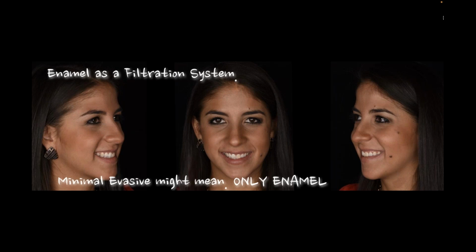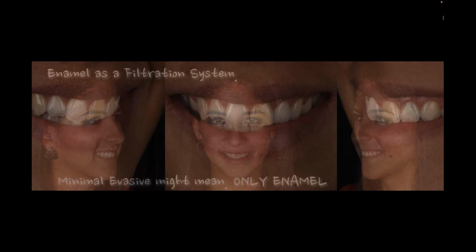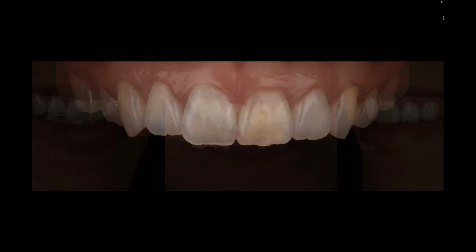So in the end, I could tell you that we'll go through the case a little bit. I won't bore you with all the details. We wanted to do a little crown lengthening because I wanted the gingival architecture to be, well, it's a young girl. She's 24 years old. We don't want to prep the teeth out. So we're really just going to take off her enamel and then try to mask a little bit of that color behind it, but also get the same translucency and the same mamelon structures and all those things.